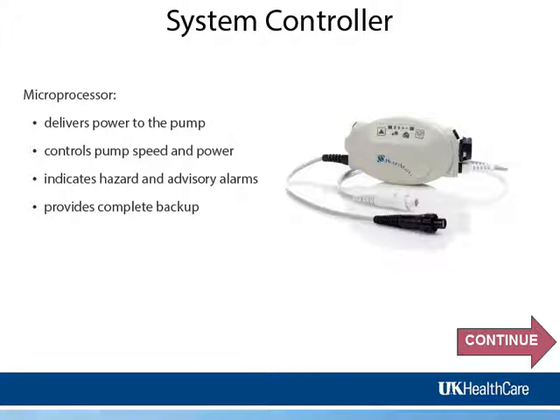In addition, the data logger can be set up to record pump parameters routinely at a preset interval from 30 minutes, 1 hour to 24 hours, in 1-hour increments. This must be turned on and set up using the System Monitor Save Data screen. It will store a total of 120 events, this includes alarms and non-alarm events. Then it will erase the oldest and store the newest.